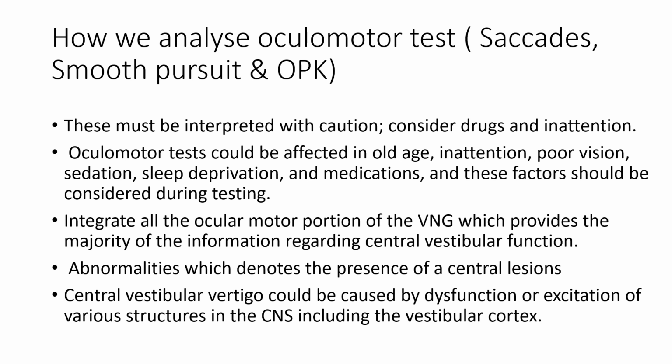After that, we must integrate all the oculomotor subtests to get information regarding the central vestibular function. Any abnormalities will denote the presence of central lesions. This information is useful in making a diagnosis of vestibular problems besides the other vestibular assessments that we have.